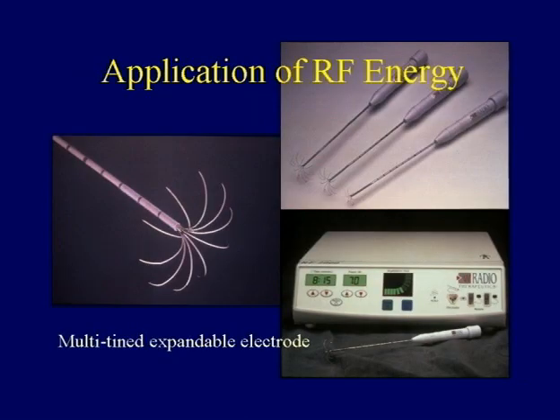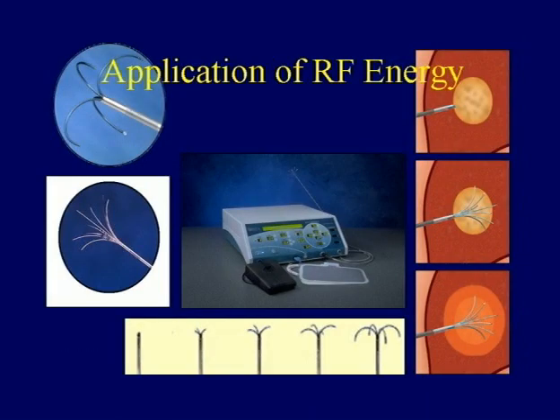And here you see the kind of needles that we're using. These are needles that are really designed for the liver and have not been modified dramatically. There has been some modification over the last few years, and these, in fact, are the latest needles that we are using. And we favor the ones with the multiple tines for reasons I'll show you in a moment. And diagrammatically, of course, the reason is that what you want to do is place the needle in the lesion so that the tines have a nice radial relationship, and you are at the tip of the lesion, and you're looking for this burn effect on the outside.